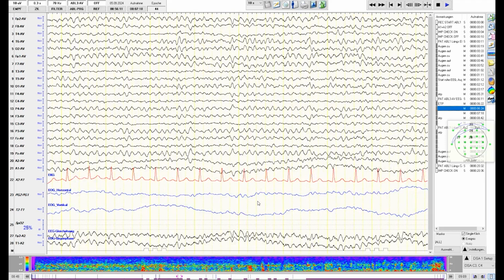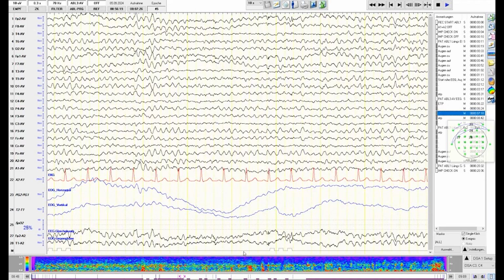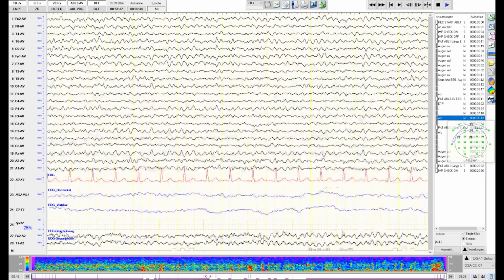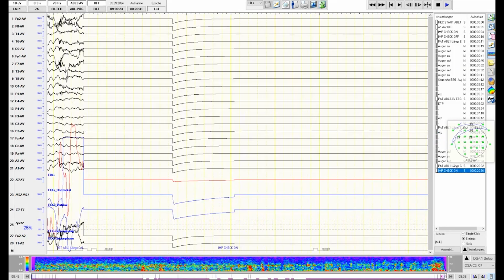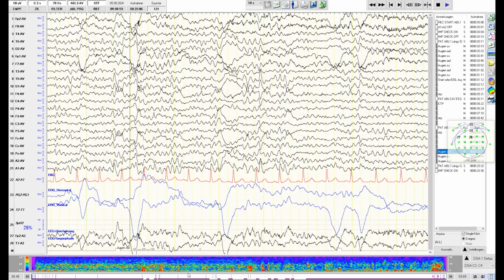And if you go to the EEG, you see other potentials, as you can see here. And maybe we go a little bit further. And let's see, maybe we find something else. And you see something here. Again, a small spike and then a slow deflection following, which is typical for this ETP and the spike wave complex. We go a little bit to the end because I discovered, just in preparation of this, something that I hope we can see.